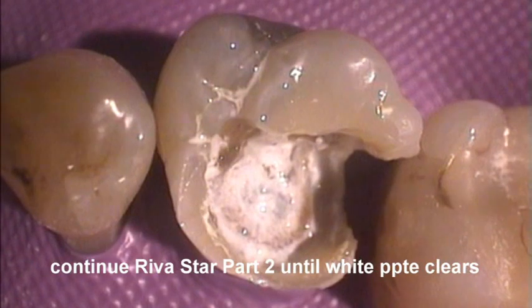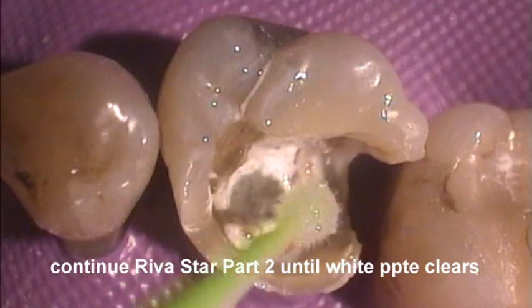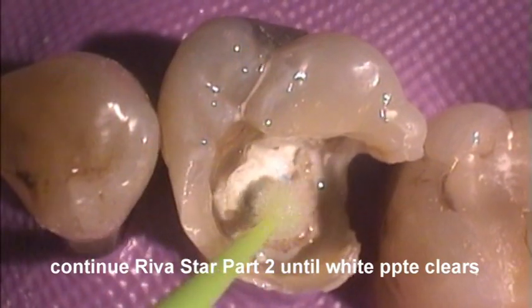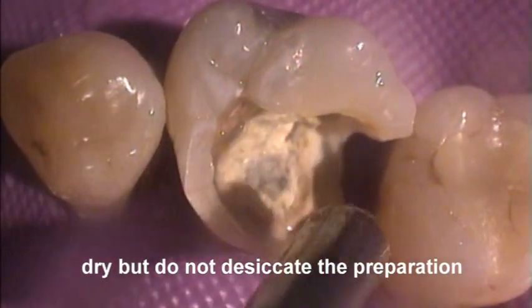Continue applying the potassium iodide solution until the white precipitate clears from the preparation. Immediately following potassium iodide application, flush the cavity with water. Dry but do not desiccate the preparation.